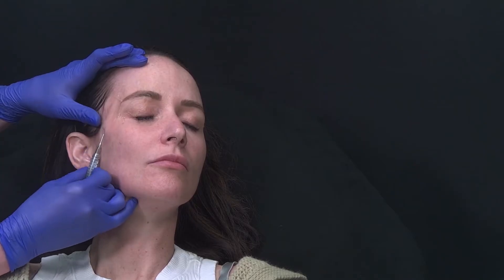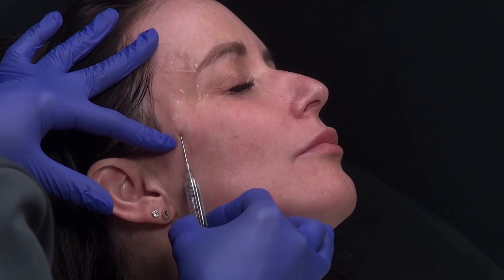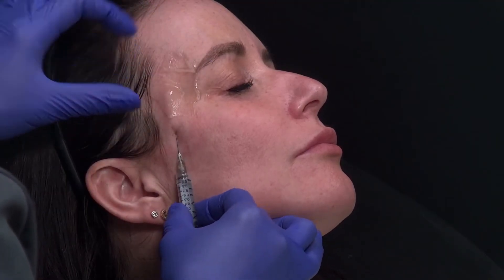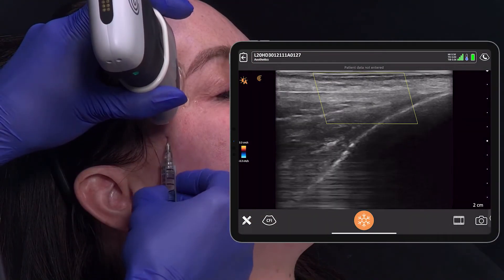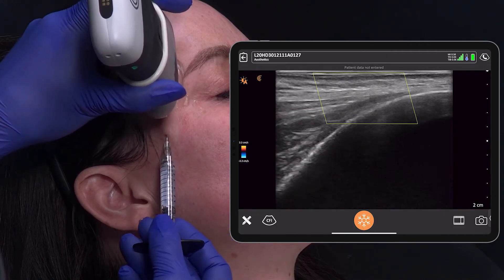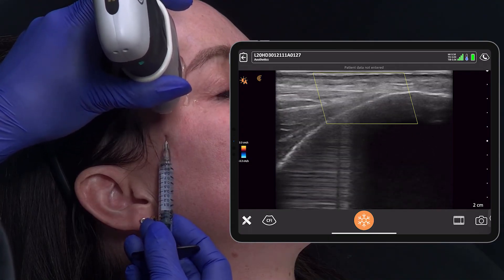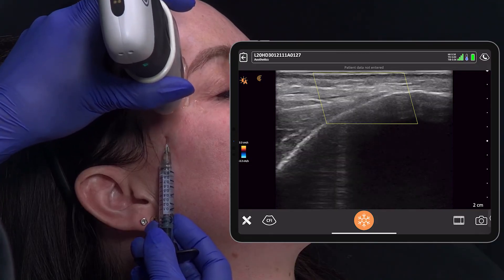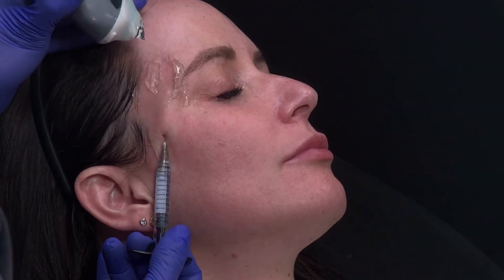I've verified my cannula position, so I'm going to go ahead and do a little bit of pre-tunnelling to separate out this layer in the whole temporal area without adding any filler at this point. This is important — if you don't do this, you can end up with little finger-like strands of filler visible through the tissues. I do this very gently until I can feel the cannula move freely in this tissue layer. I'm using a low viscosity cohesive product with low extrusion force — in this case Miley Define — which spreads in this interfascial layer beautifully but still gives excellent volumization. I see my cannula tip and my color box is on it, so I'm verifying I'm not too close to vessels. I am happy with this, so I can go ahead and inject.